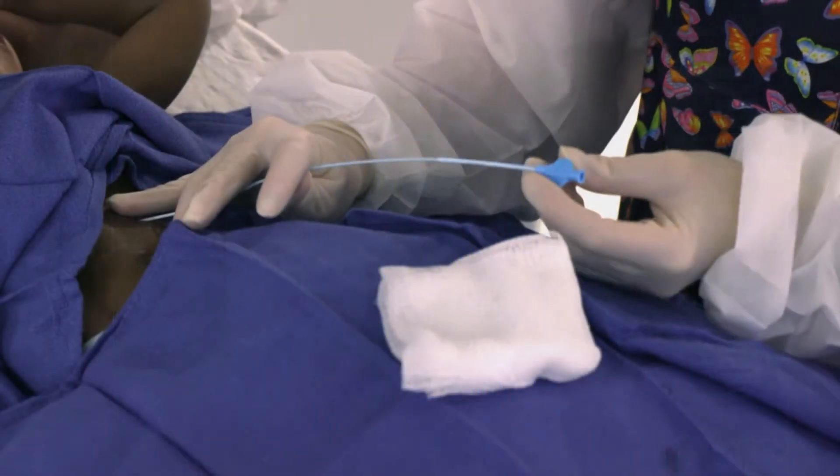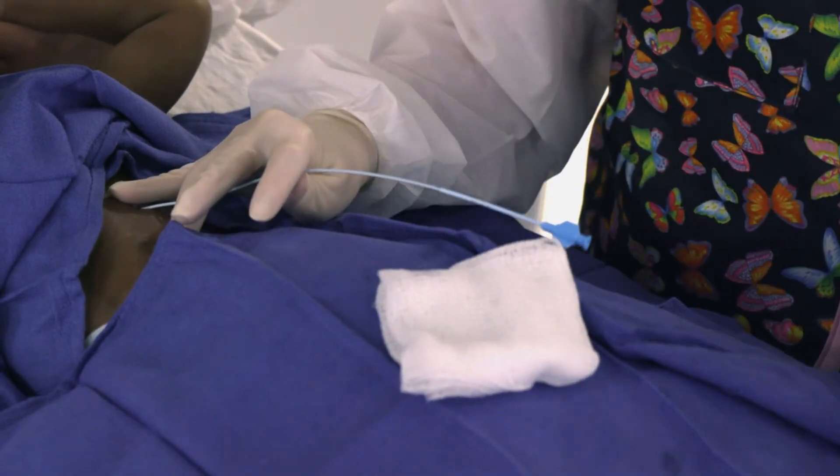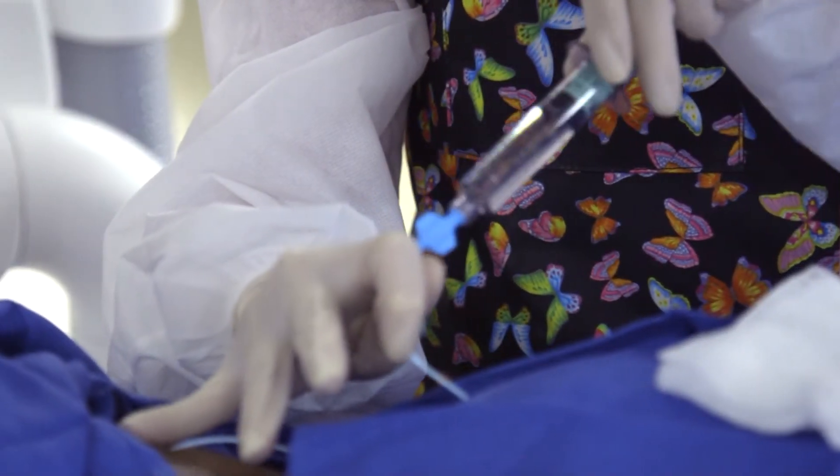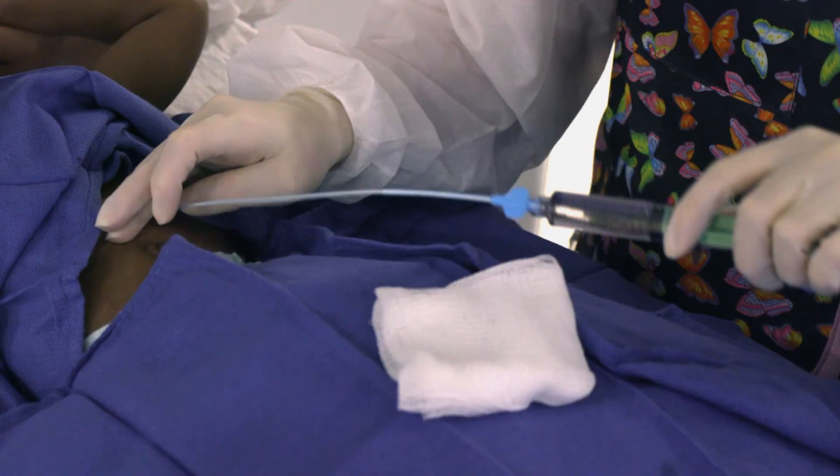In this situation, because our patient actually had malrotation, instead of the normal C-loop that you would see on a patient with normal duodenal anatomy, her small bowel went inferior and then stayed to the right side of the abdomen. To confirm that I was still in a good position, I actually injected contrast through the catheter so I would know which way I needed to go with my guide wire and gastrojejunostomy tube.